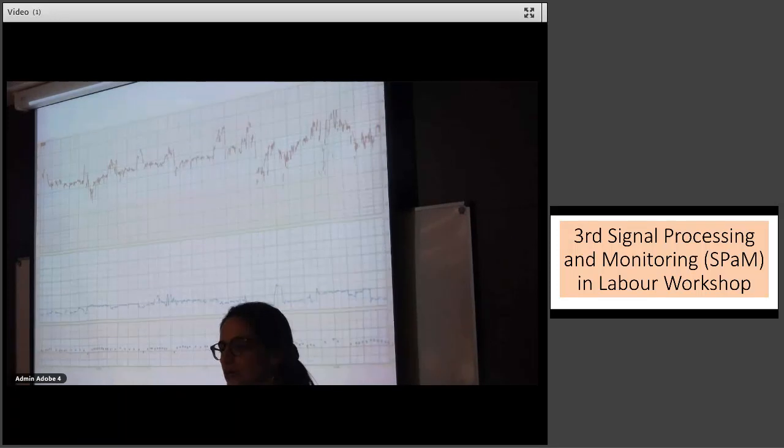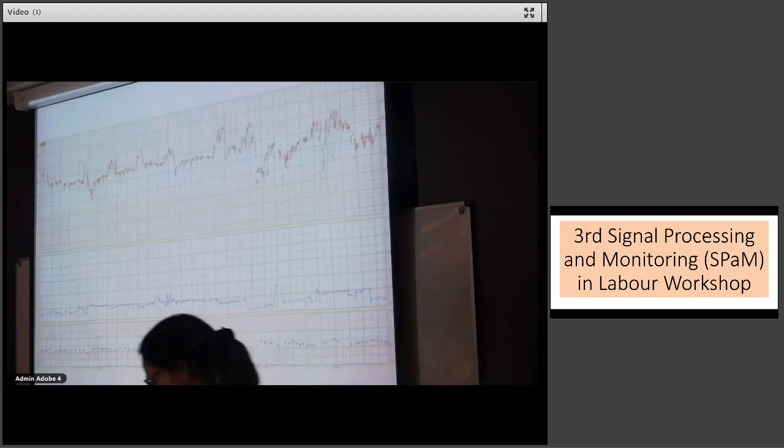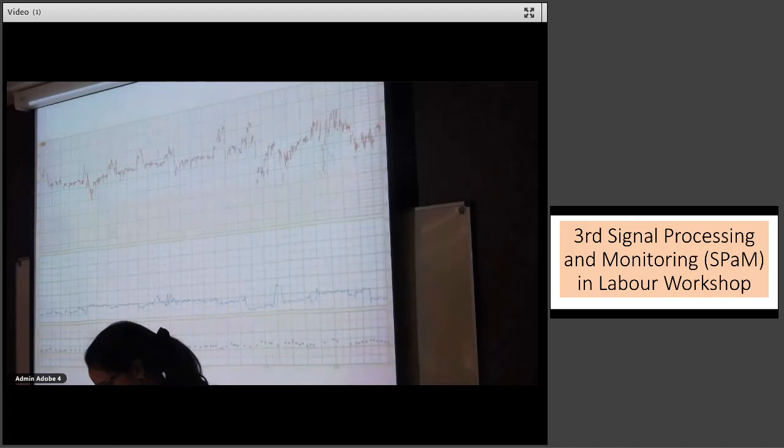So shall we agree that we would monitor mom's heart rate? Definitely. I'll be asking what the mom's heart rate is to start. Well, I can tell you it's normal. I don't know what it is, but it's normal. We checked that. This was many years ago here in Porto, and it was normal. It would come as a surprise if she's as hot as 38.5 and then runs a normal heart rate. It was normal at this stage, not before. So it's something like 1 hour after that initial period.